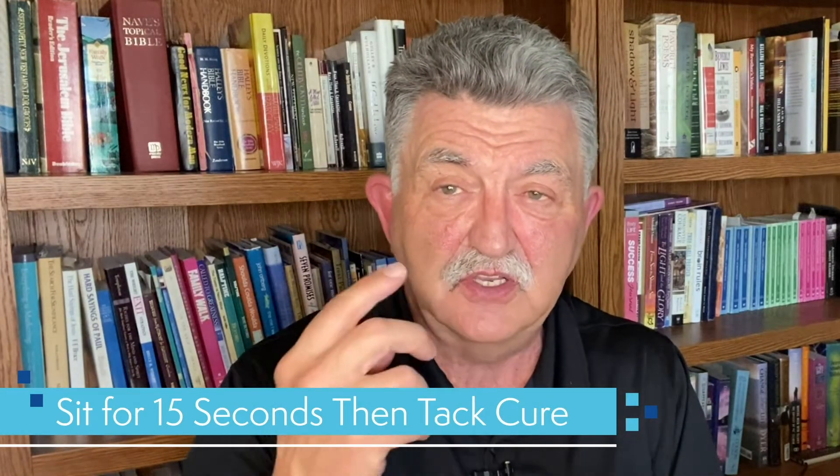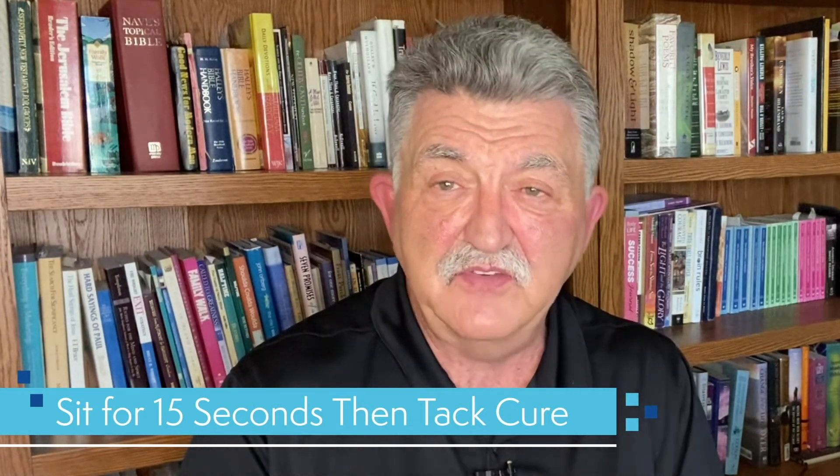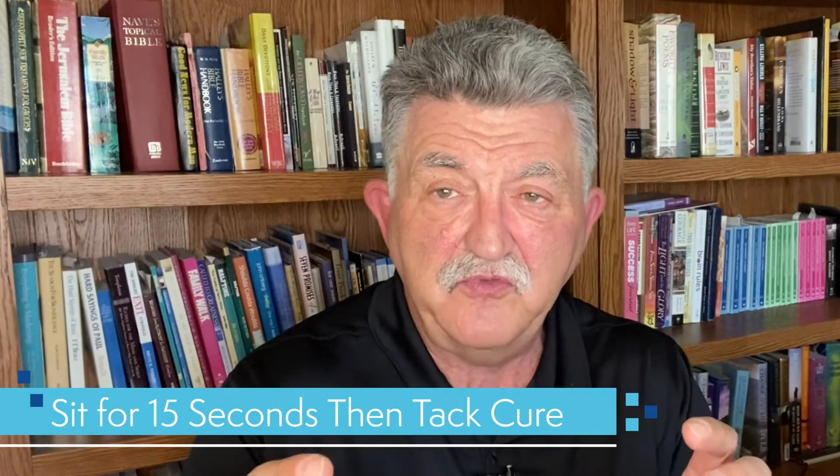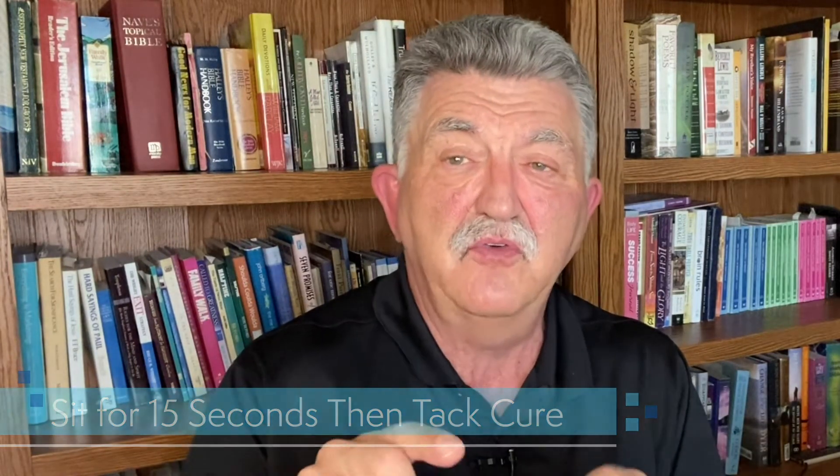Now I'm ready to cement. The way I like to do it is to cement the two centrals simultaneously. I get the cement and the crowns, place them up, and just let them sit for 15 seconds. After 15 seconds, you can tack cure from the facial and lingual — five seconds each. Once you've got a tack cure, you tease away the excess cement. While you're doing that, your assistant is already filling up the lateral incisor crowns. You place the laterals, let them sit for 15 seconds, then tack cure facial and lingual for five seconds each, and gently remove the excess cement from around the laterals.